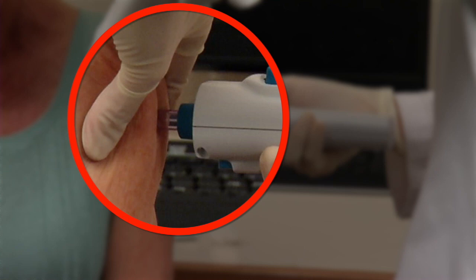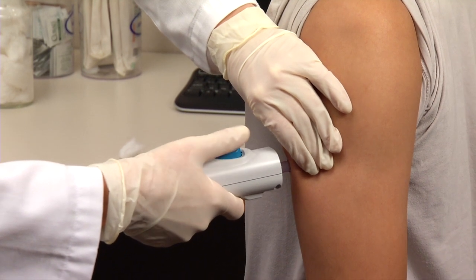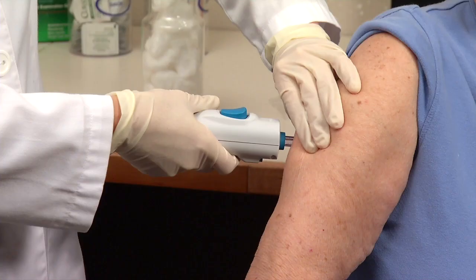For a subcutaneous injection, pinch or tent the skin and inject into this elevated skin as you normally would while maintaining the 90-degree angle. This limits the depth of penetration and assures proper subcutaneous delivery. With a normal-sized adult arm, the standard technique for injection is into the subcutaneous space over the posterior triceps muscle. This technique is the same regardless of adipose tissue quantity.